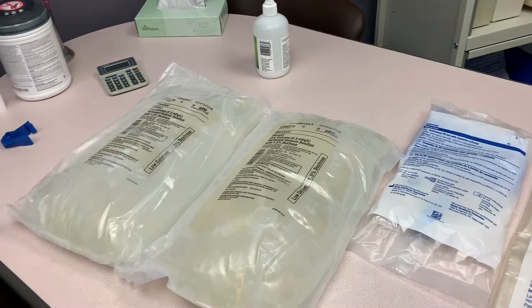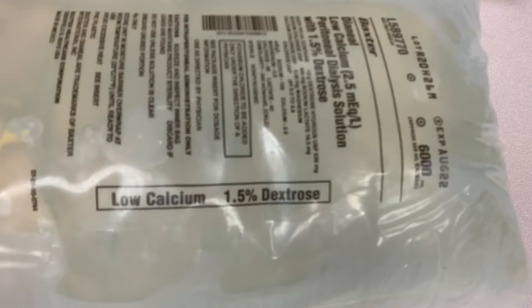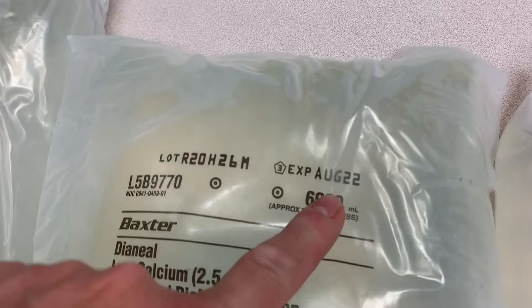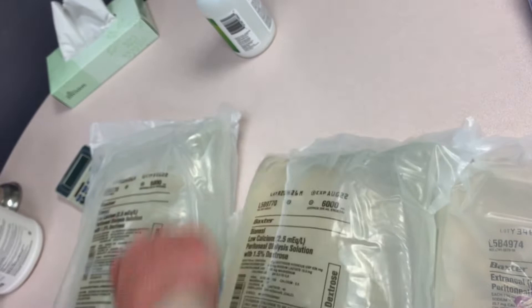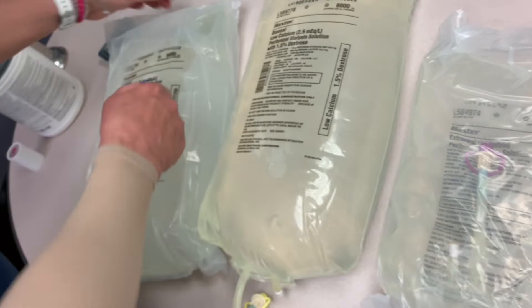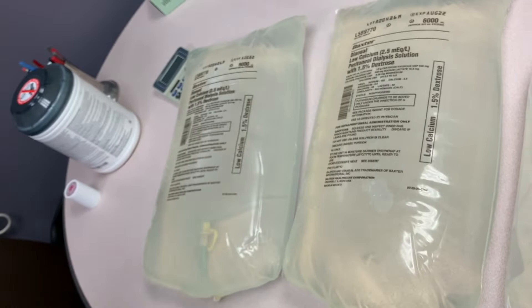Here's a six-liter bag — you want to check the strength, expiration, amount, and leaks. The strength is 1.5% in two places, the expiration is August 2022, the amount is six liters. Make sure there are no leaks. You can open the bags — it's normal for them to have some condensation, but there should be no leaks. If they do, throw them away. Check them like you would any medication.